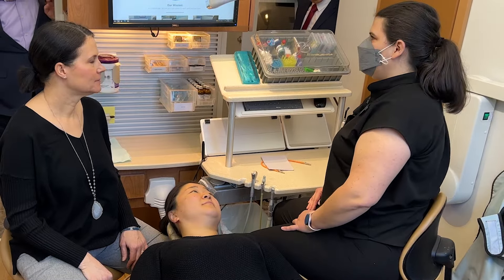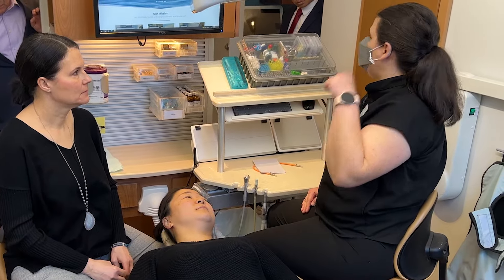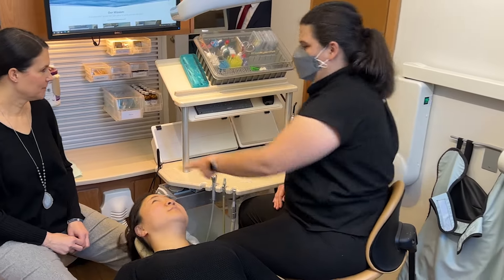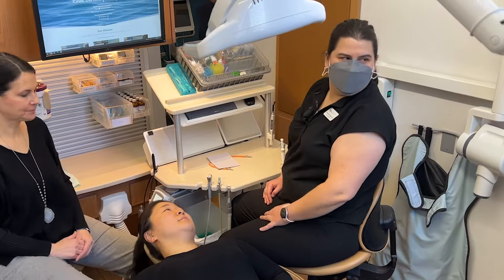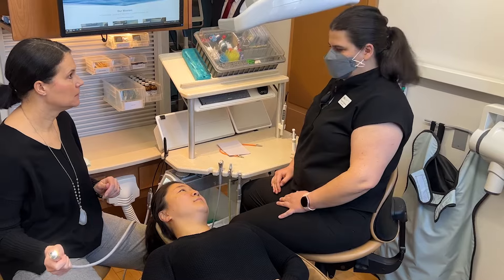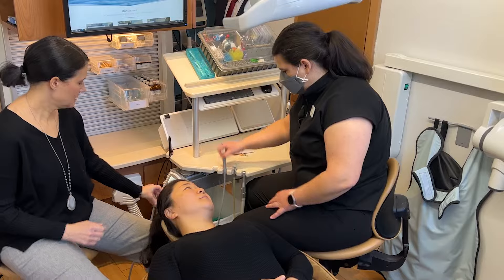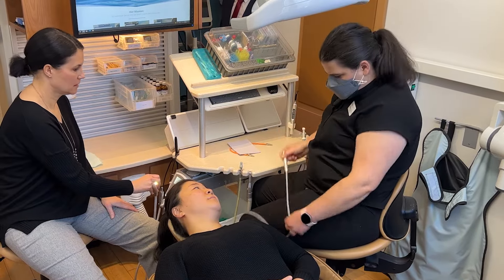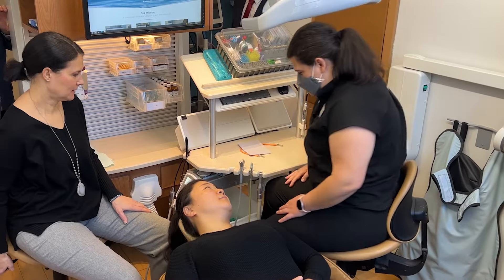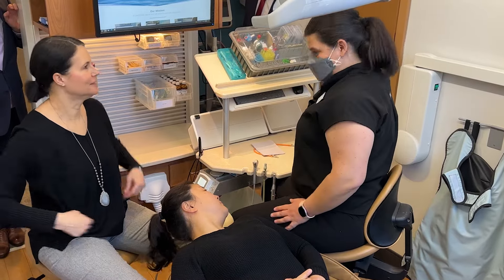If Dr. Puggett should choose to use her dominant hand, it is very subtle. It is on one video of Dr. Hearn — he rolls his chair back and grabs with his dominant hand. Usually it's your non-dominant to switch over. That's the only con of the system. I like the rolling back because we all know these cables stick to scrubs. The position we would take would be closer than ever before.